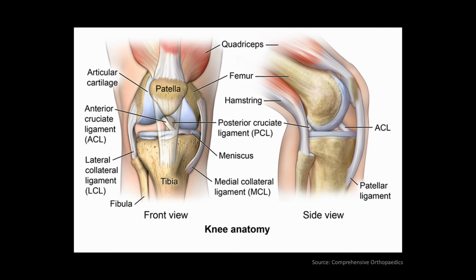Here's just a reminder of our knee anatomy. In the anterior view of the knee, we have the tibia inferiorly, we have the femur superiorly, and then certainly the patella, with the articular cartilage of the joint space deep to these things. You won't really see much of the articular surfaces of the knee via ultrasound because there are not a lot of sonographic windows.